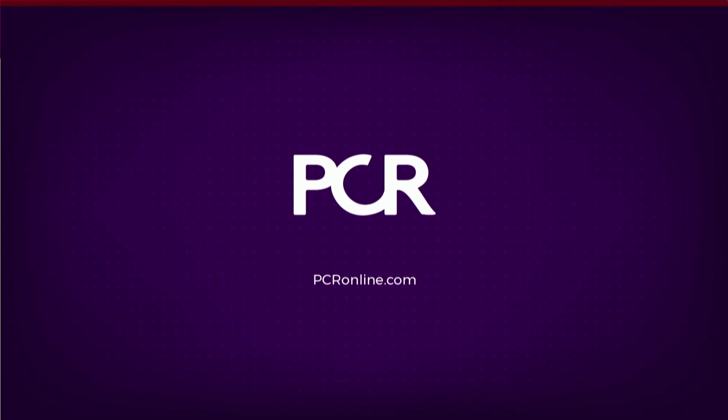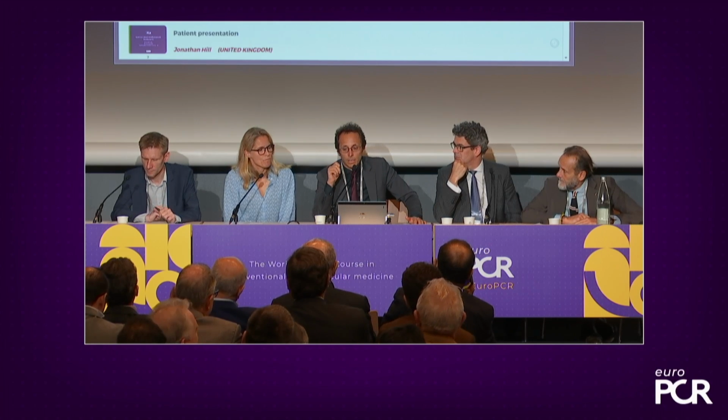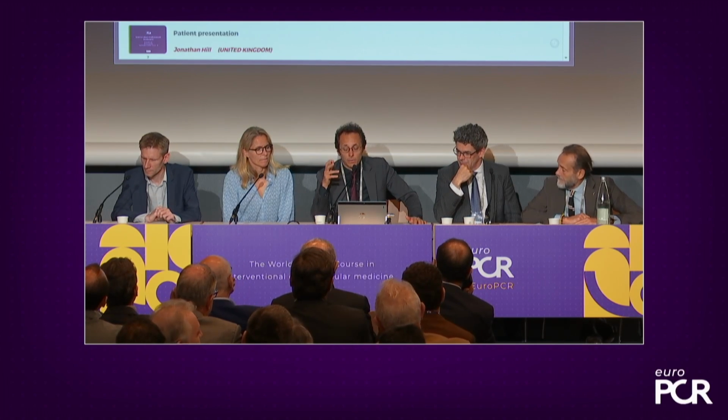Yeah, I think it was an absolutely great case, Benjamin. Thanks a lot for that. So, summarizing the case, what we've learned here is that, as you've seen, IVL can be absolutely safe in left main stenosis. Even the time of inflation of the balloon did not cause any hemodynamic compromise to the patient.